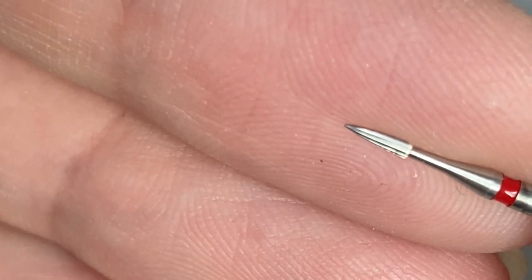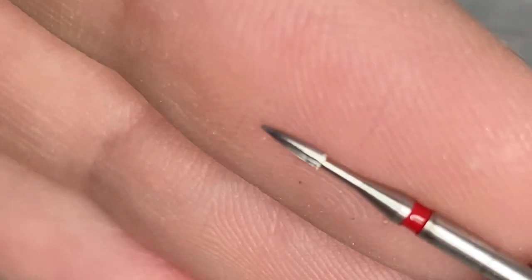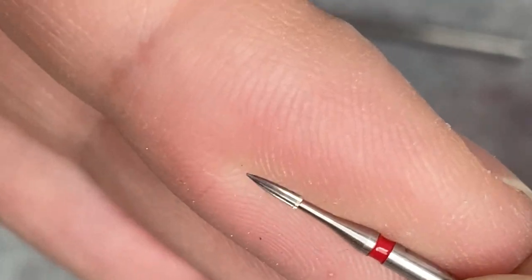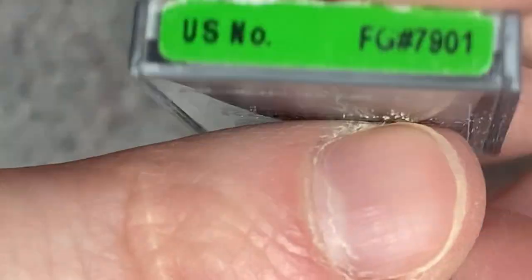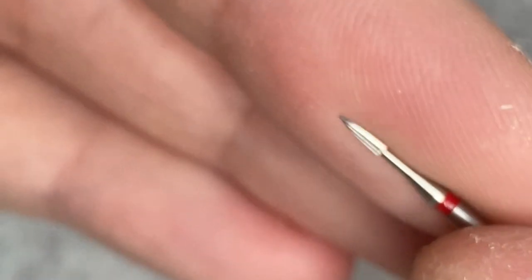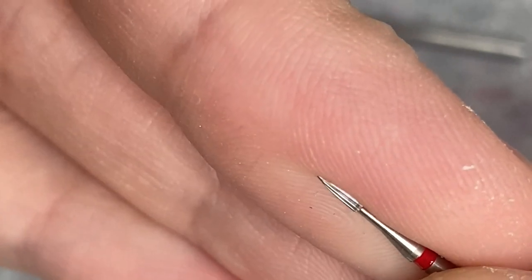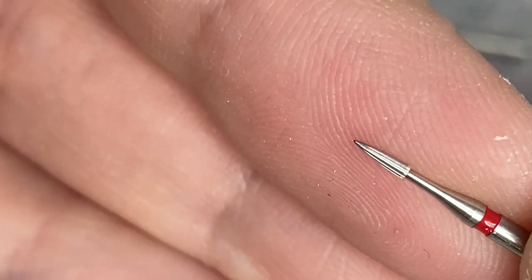Sometimes you ask me about this burr that I use for occlusion — it's for high speed and that's number 7901 by Comet. Sometimes you ask where to get them: we buy them at Zandental, Henry Schein, or American Dental Depot. They're very good for occlusion.